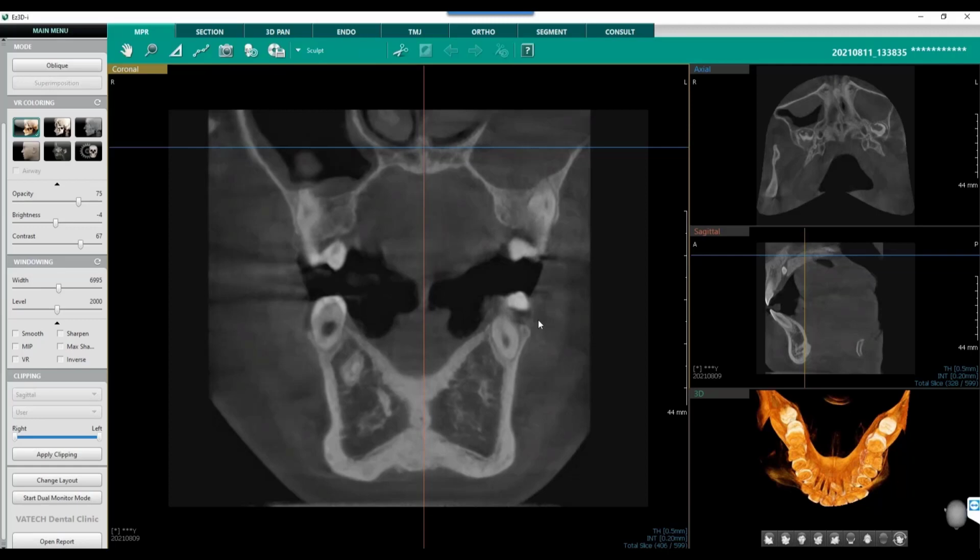Paul, do you want to take us through 3D pan and easy, quick views of that and ways we can take some screenshots, and maybe if we have time, we can look at our consult videos?